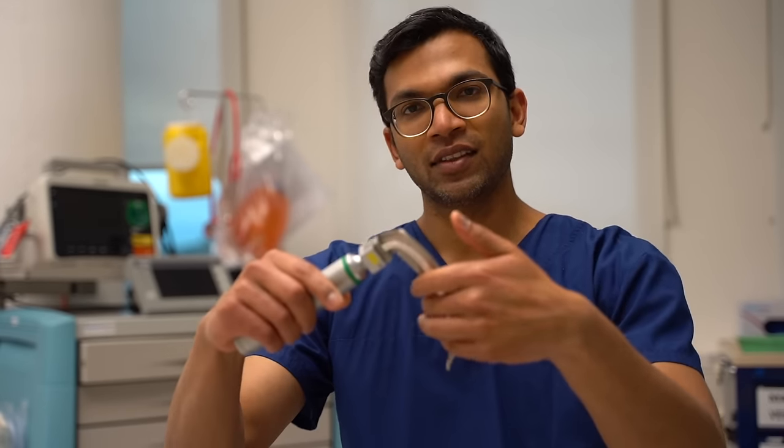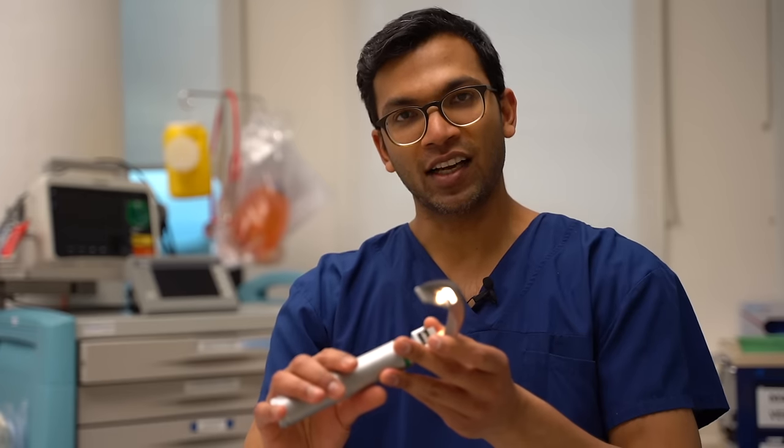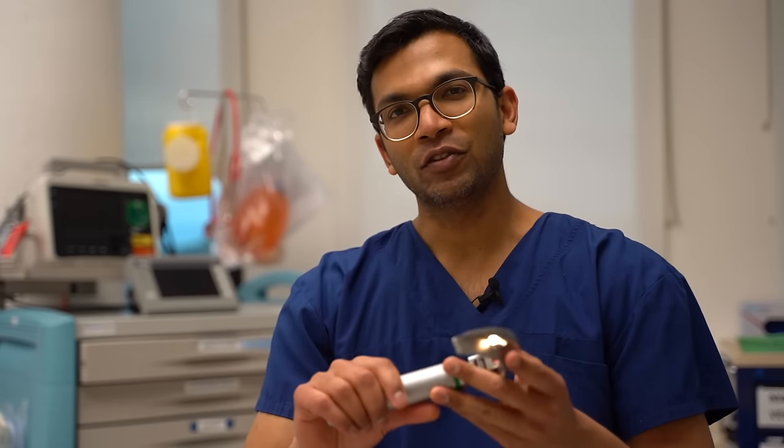You can just latch it on like that. What I do then is I check that the light is working. One of the most important things is that you need a really good light. If this light isn't bright enough you'll be in there trying to find the trachea and everything will just be dark. If you really want a bright light, this is what makes or breaks a difficult intubation.